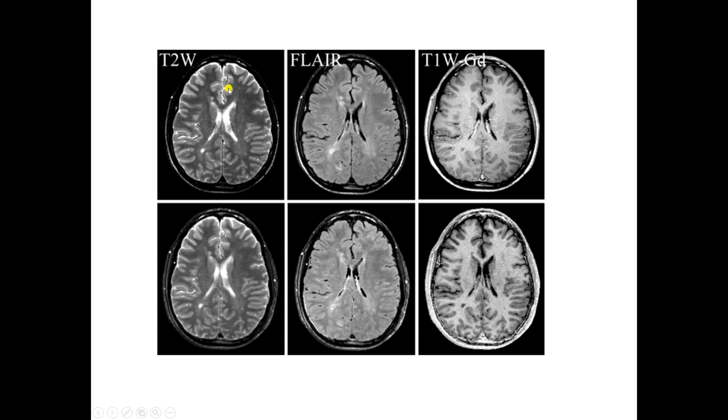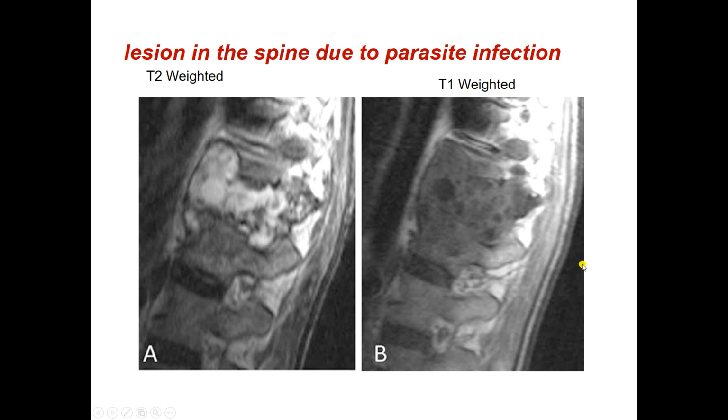Again, T1 weighted with gadolinium, we'll see what that is in a bit. T2 weighted of the brain, exact same slice of the brain, you've just done a different experiment. Here you can see a lot different detail in the ventricles than you do over here. On the other hand, the difference between the gray and the white matter might be more pronounced here than it is here. So in practice, you would acquire all of these images, right, and do something with it.